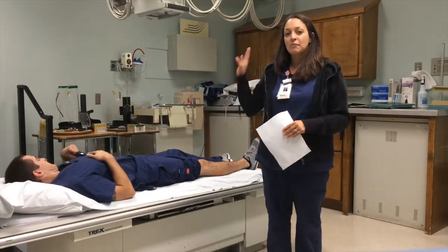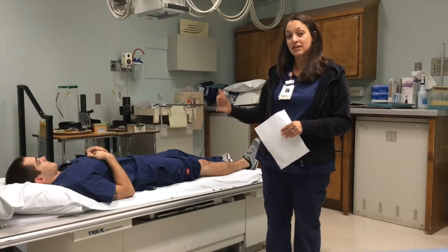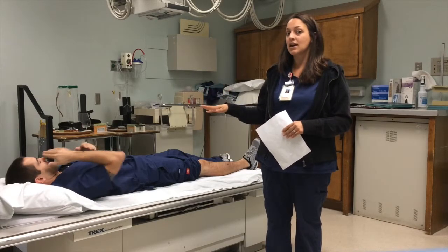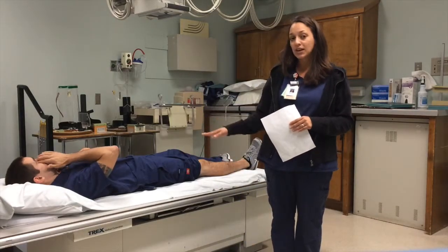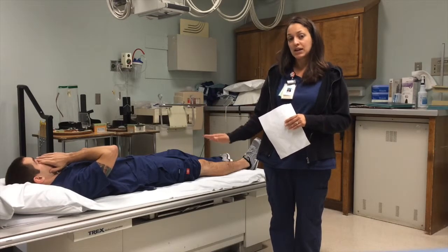So I'm going to start with the AP knee. For the AP and my next view, which will be oblique, there's an ASIS measurement from that to the table, and he looks like he's between 19 and 24, which there's no angle on it between 19 and 24.